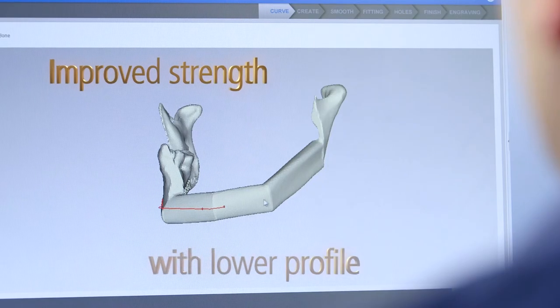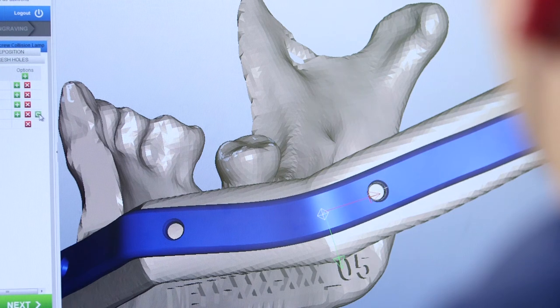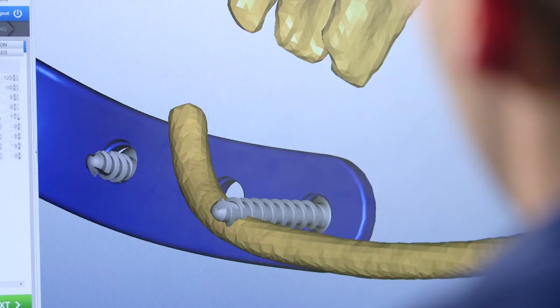Surgeons can now choose plate profile, trajectory, and length, hole positions, distance between holes, and their individual angulations.